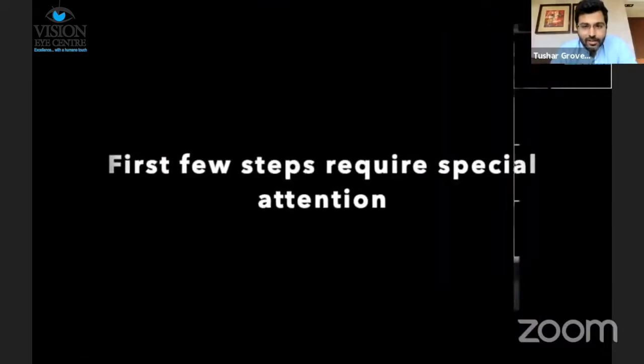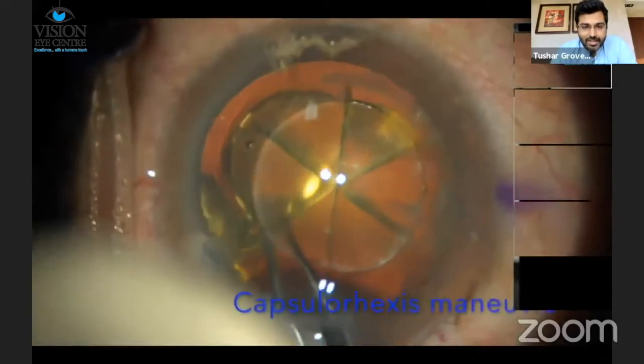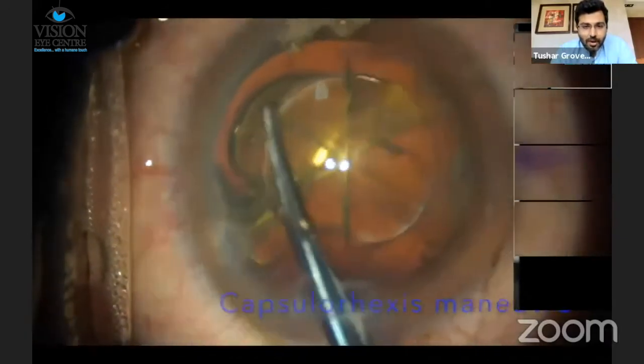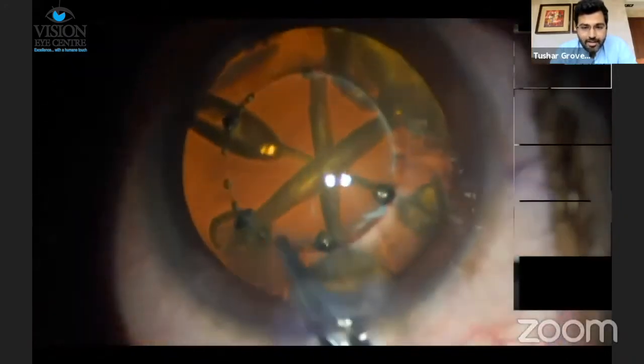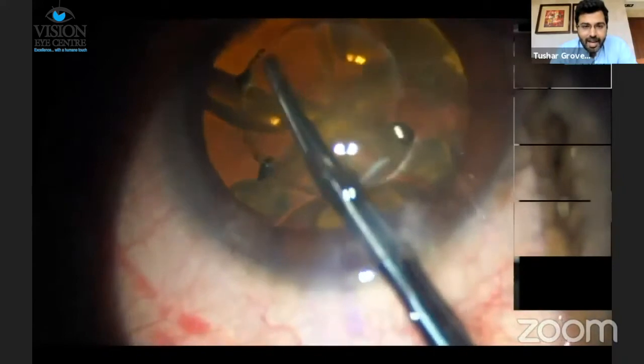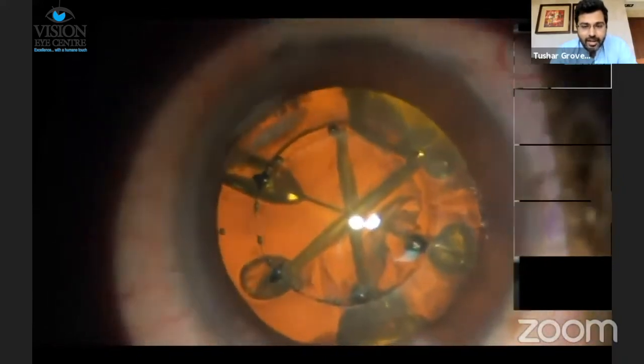So it's important to be very careful with these first few steps in femtosecond laser, as we saw in these two cases. It's important to remove the anterior capsule as if you were doing a manual capsulorhexis, so that in case there are any incomplete tags, you still end up getting a round, circular, complete rhexis.